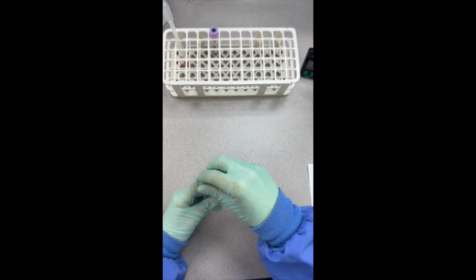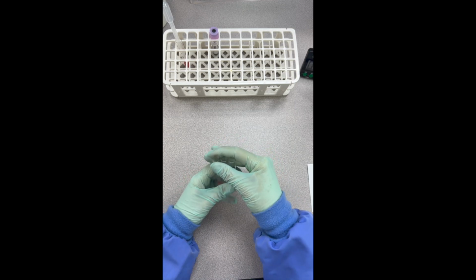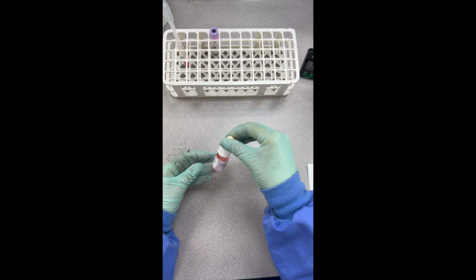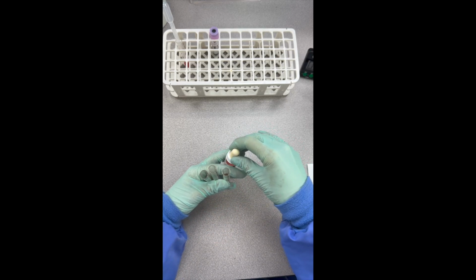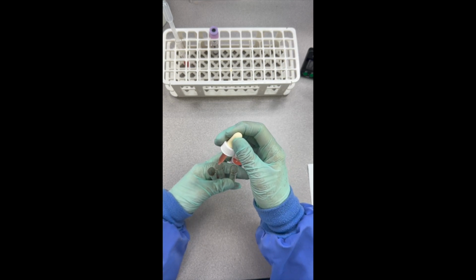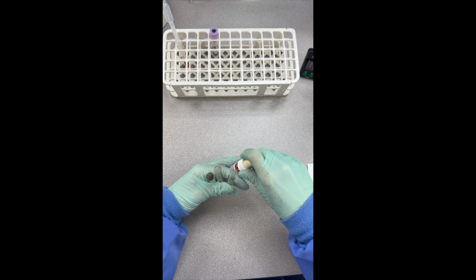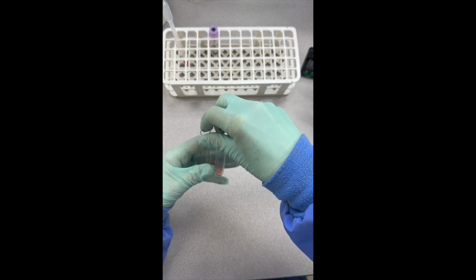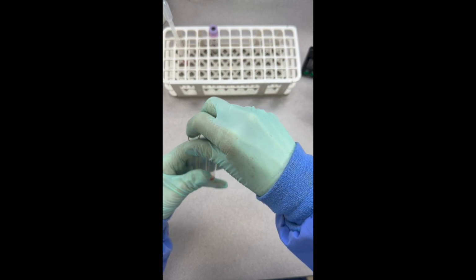And we're back. So these guys have washed. Okay. And now what we're going to do is we're going to add 1 drop of indicator cells. Okay. And these indicator cells are Rh positive cells. And I'm going to draw you a picture here after we add these. So 1 drop into each of these. 45-degree angle. Working on that. Okay. Nice job. Indicator cells. Now what we want to do is resuspend those all in there. Give them a mix. We're going to go put them in the centrifuge.